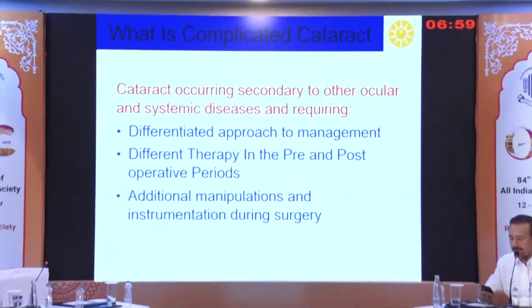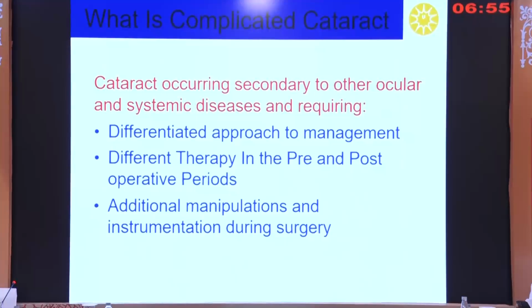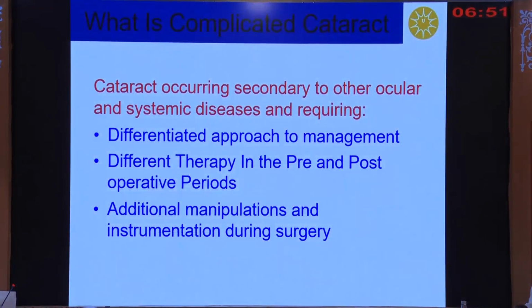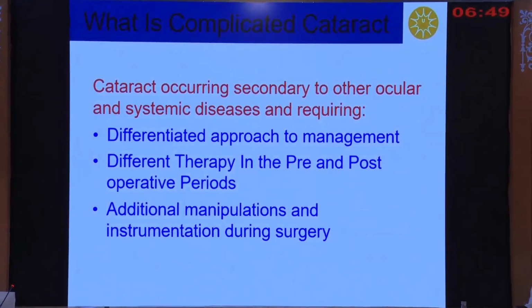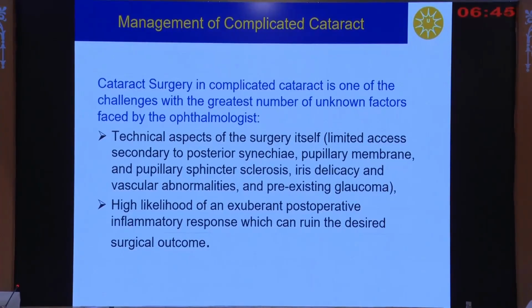My topic is the way to deal with the challenging case of the uveitic cataract. As you all know, the complicated cataract is secondary to other systemic conditions, and it requires a different approach to management, different therapy in the pre and post-operative period, and additional manipulation and instrumentation during the surgery. The complicated cataract is one of the most challenging, with the greatest number of unknown factors faced by the ophthalmologist.